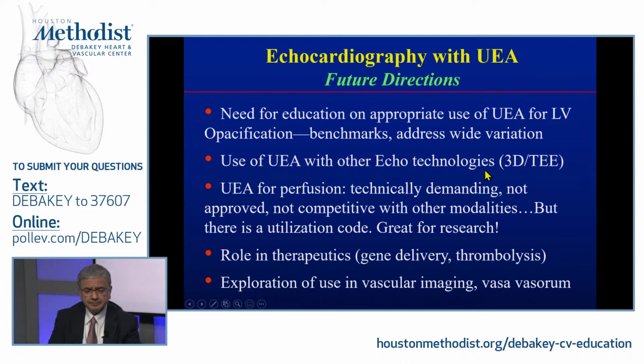The other thing is, we do hope that our industry partners improve the technology of 3D in relation to ultrasound enhancing agents, because in 3D obviously you're sending much more in the field of view, so you can destroy much more contrast because you're not sending it as just one plane.